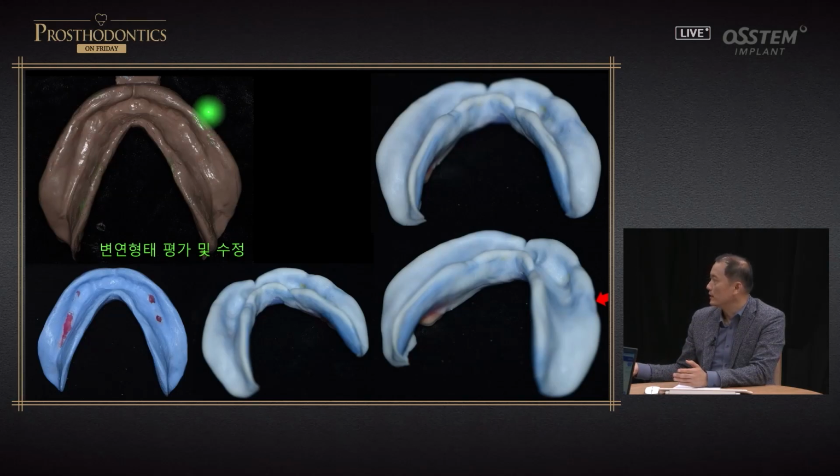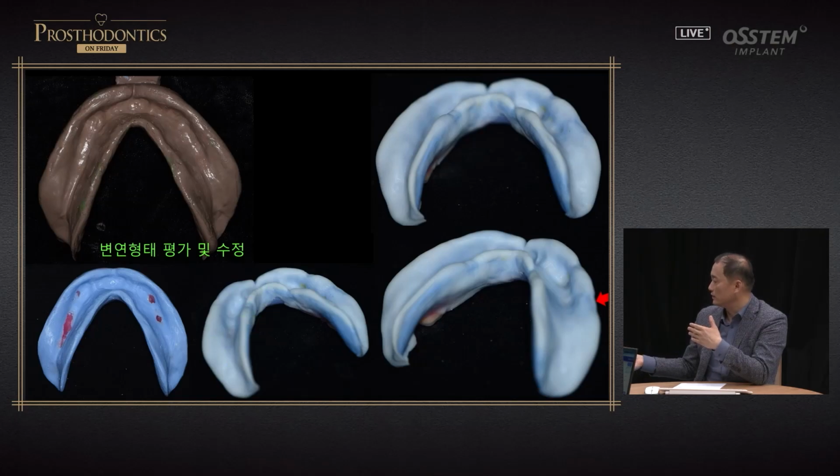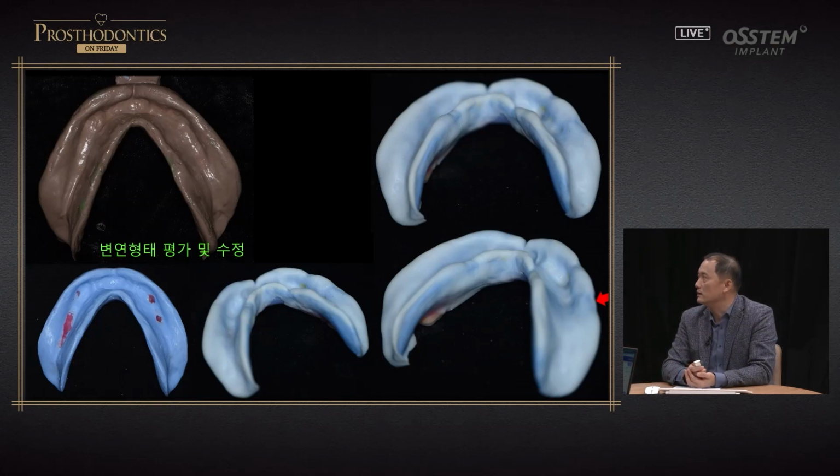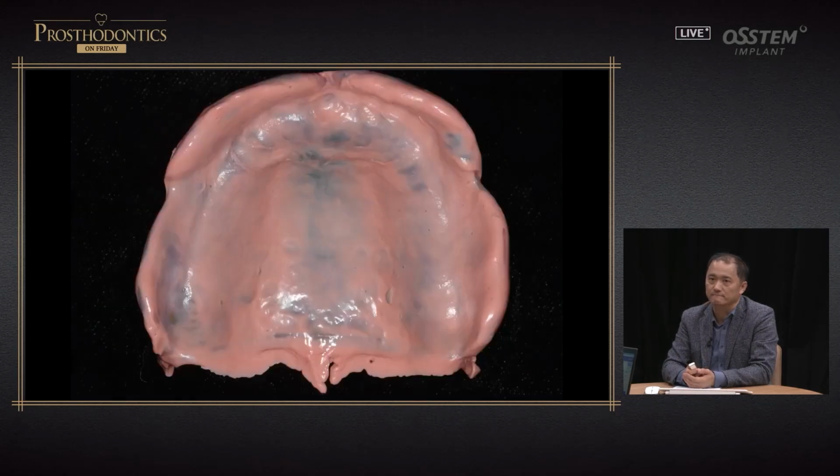Through the fit checker or through various things, you check all these different areas to see whether it would fit correctly. You sometimes say functional impression or dynamic impression, these steps, but through this, borders and other things can be adjusted and assessed. Again, this is part of the functional impression. What I'm trying to say is that functional impression plays an important role in retention.